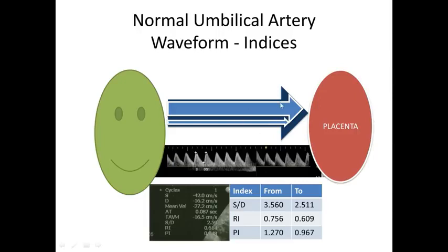Actually, with this forward movement, we can diagnose if the placental bed, the placenta, is still a low pressure, low vascular pressure organ, or if the placental vascular resistance is increasing, and with the increase in the pressure in the placenta, it starts to obstruct the blood coming from the fetus.